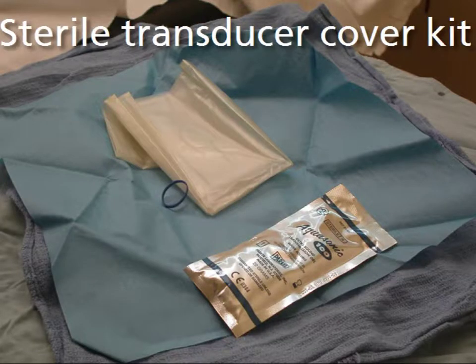If you're doing ultrasound guided procedures, you've got to use the sterile transducer cover kits. I would avoid, if at all possible, using sterile gloves because you're going to have to deal then with the fingers and it makes it more awkward. These are nice. They contain a sterile sheath, rubber bands to hold the sheath in place, and you also have sterile gel. These are easy to apply, and you can do this with one or two operators.